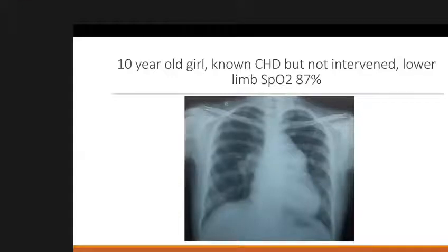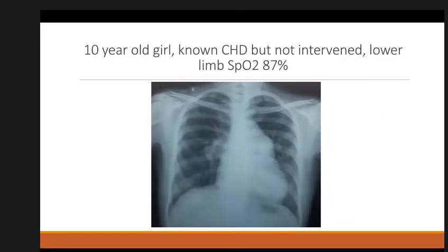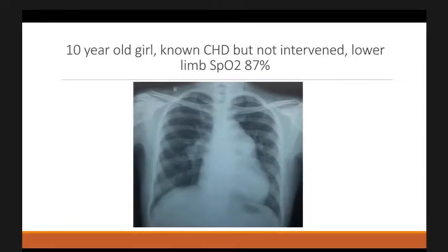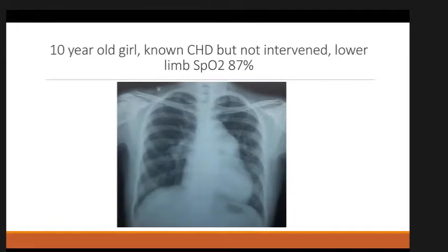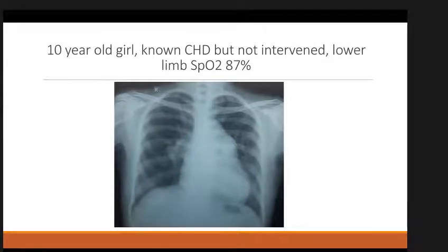From the previous X-ray. Chest X-ray PA view with a normal cardiothoracic ratio. Looks like RV type of apex.